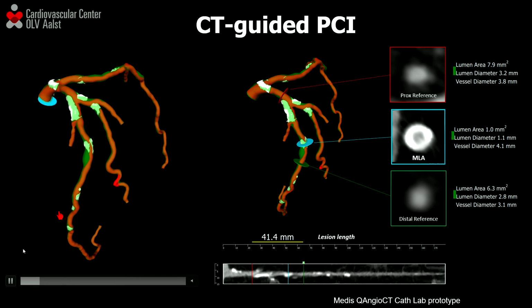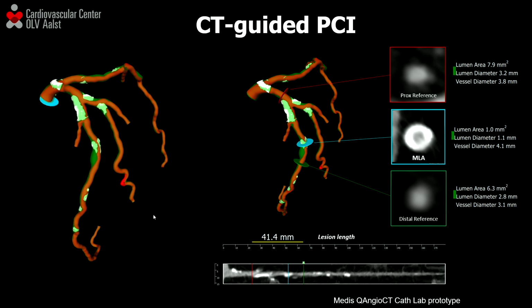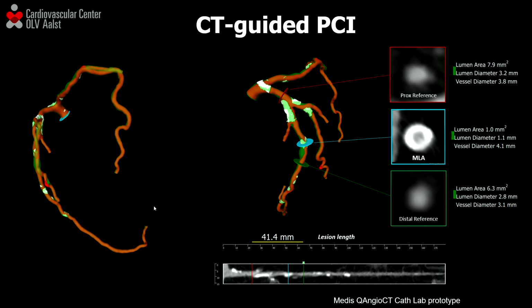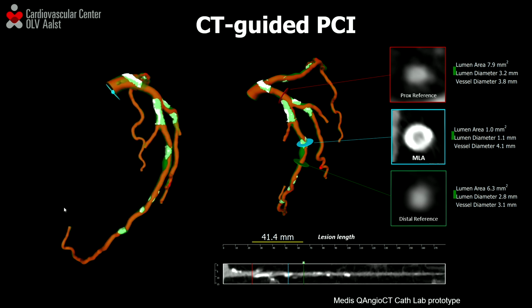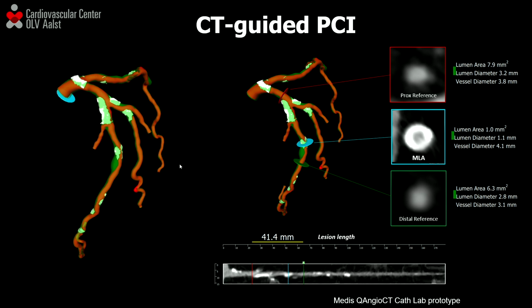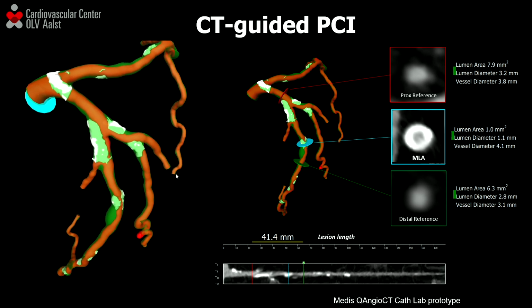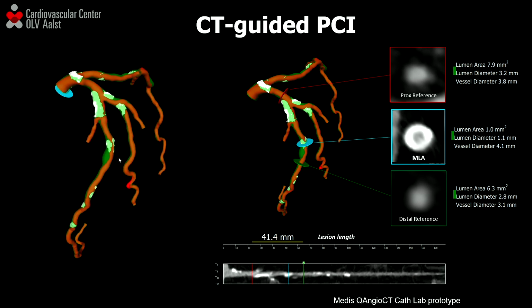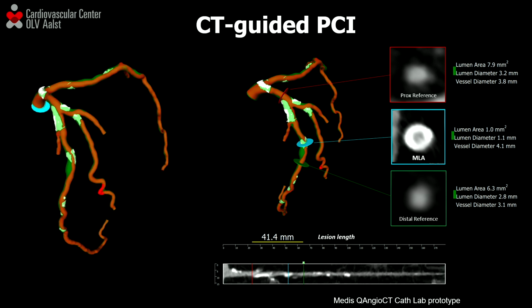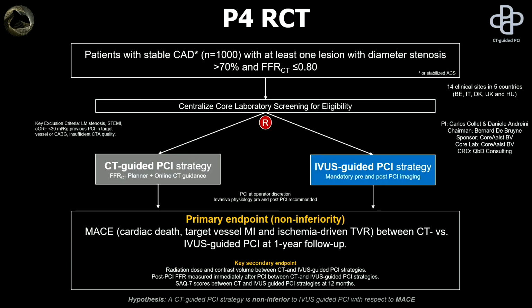This is, again, a video that helps you understand not only the 3-dimensionality of the plaque, but also provides you a correlation between the calcific plaque and side branches, and for us that is crucial because when we treat bifurcations, we can understand how the side branch will interact. In addition to that, we also have in the software, incorporated in the lab, a measurements tool, so it's also the first time that we can measure length of disease in the 3-dimensional space, and that happens again live inside the cath lab.